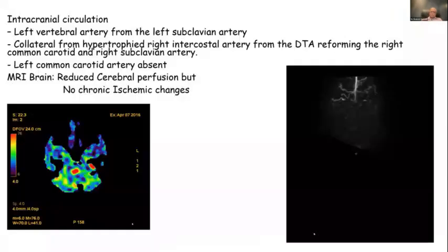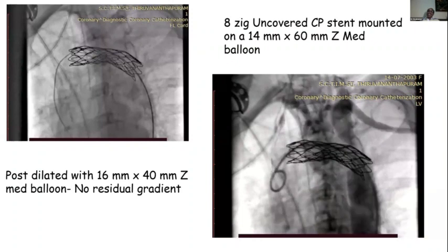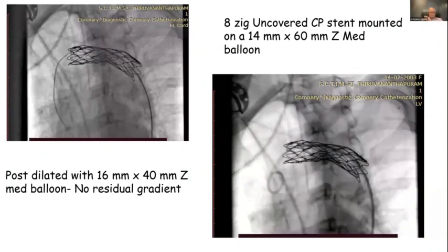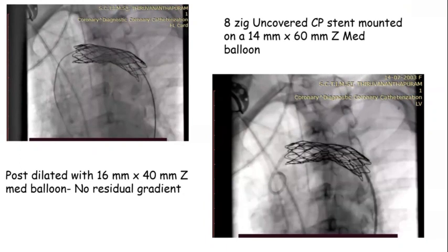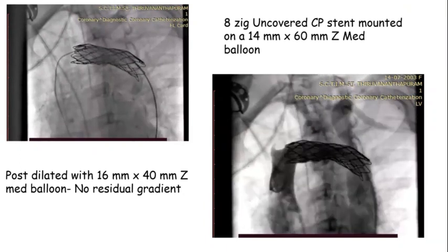Because it's a tough one. Yes, it's very tough. It's tough to imagine even what the backup plan would be. This being one of the most complicated cases in a child, we didn't want to take any risk. That's why we opted for this neurocerebral protection.